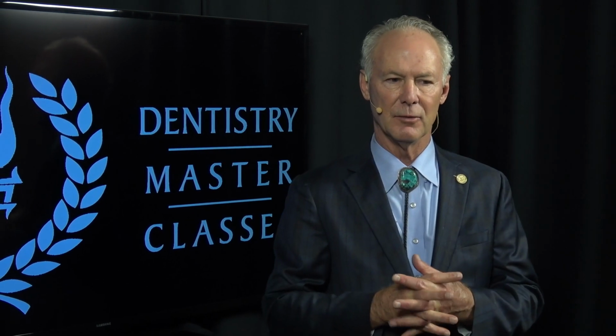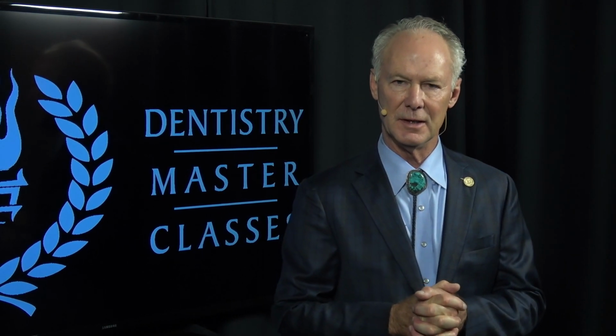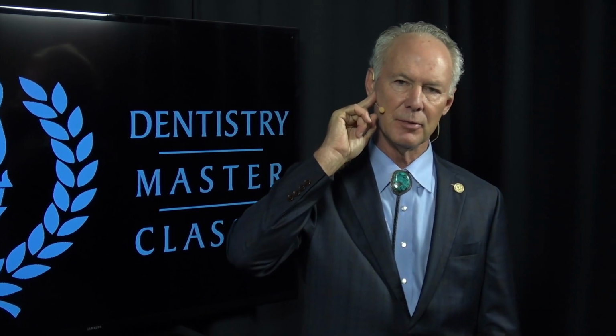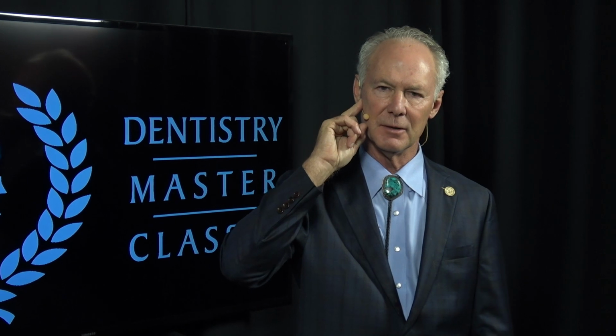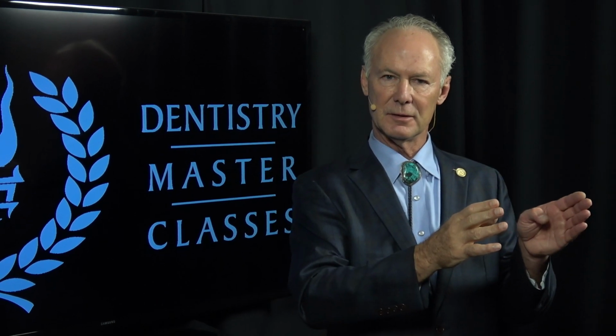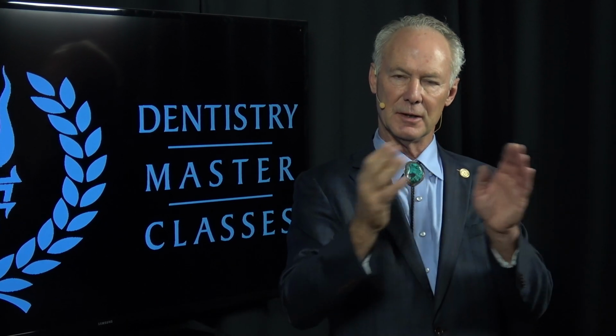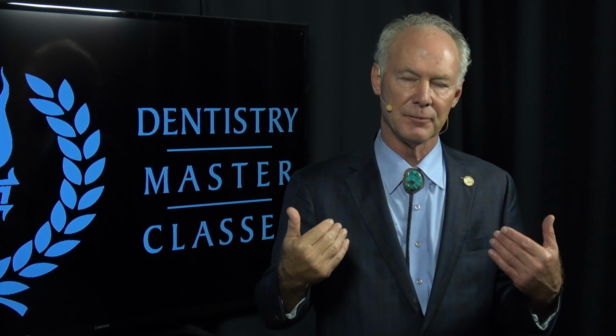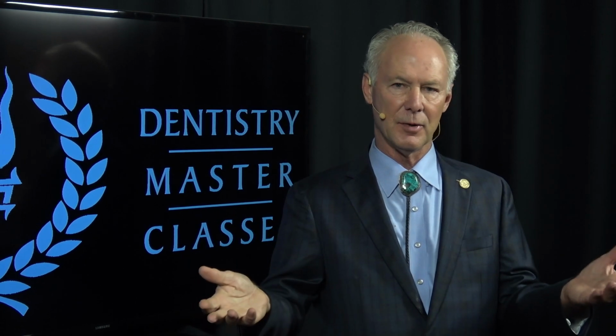So implants are a wonderful addition to dentistry, especially if you don't have any posterior teeth to hook a bridge onto in the posterior part of the mouth. You can often place an implant and place a bridge from the implant to a natural tooth. We used to think you don't want to connect bridges from implants to natural teeth. Now it's done routinely. I do it routinely, and I've had no problems with it.